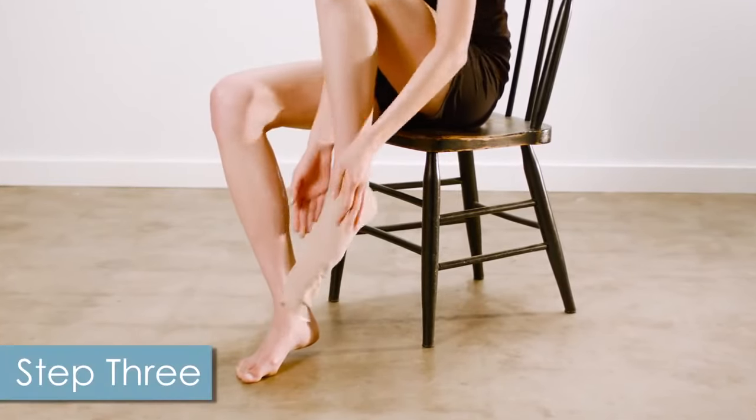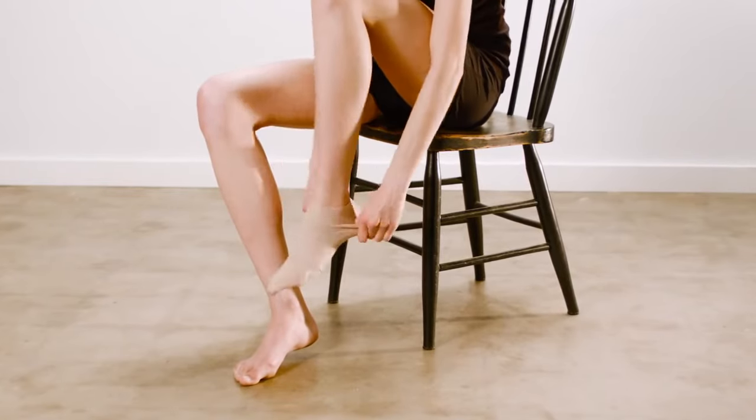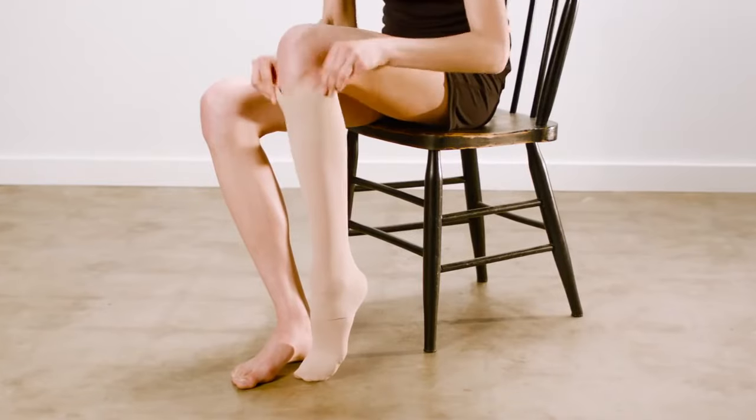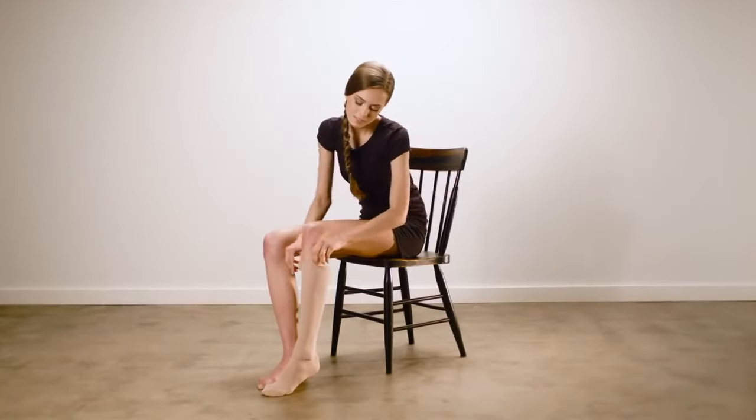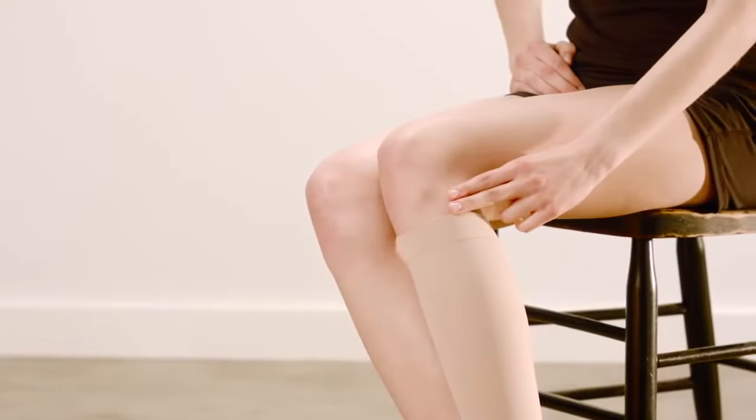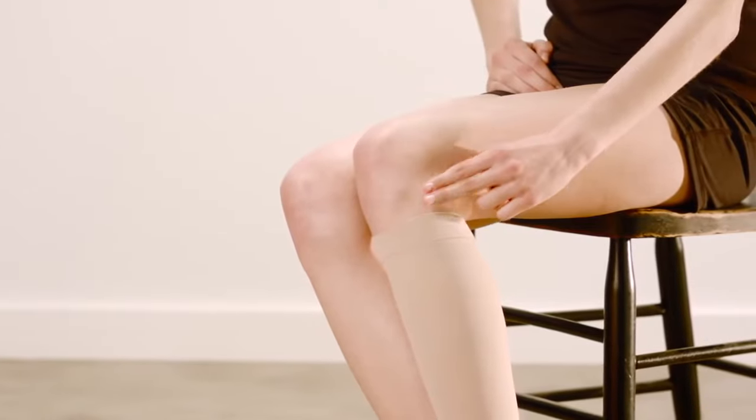For knee highs, you'll want to grasp the top of your stocking, then pull up and over your ankle and calf. For optimal fit, be sure that the material is evenly distributed on the leg by massaging the garment into place. You'll know it's on correctly when it's about two finger widths below the bend of your knee.